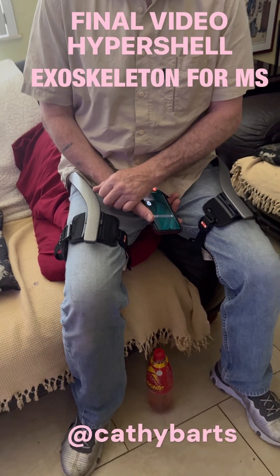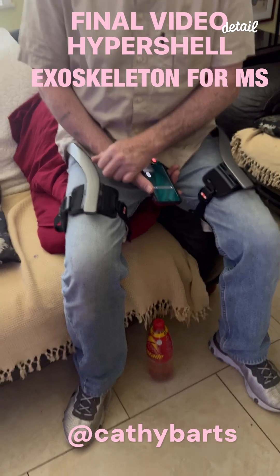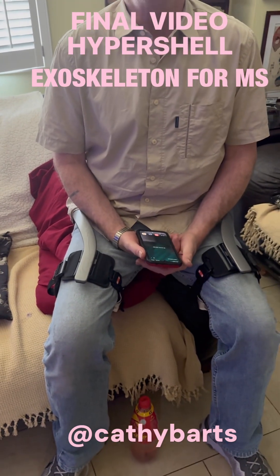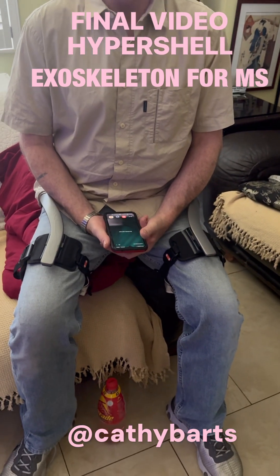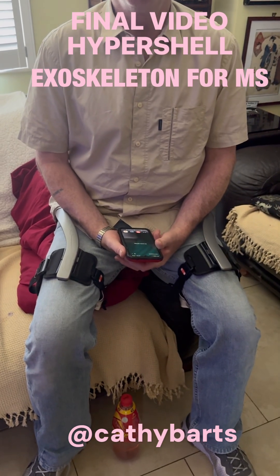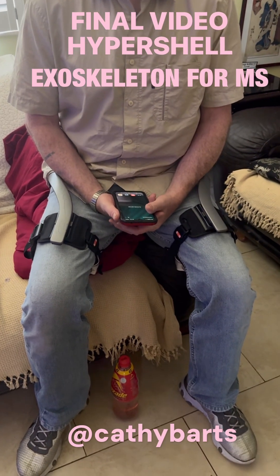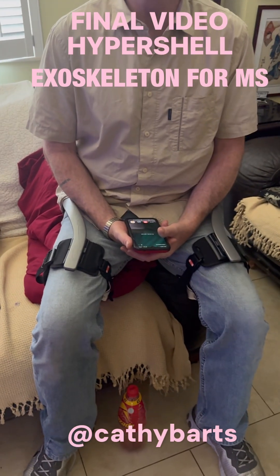This is the final video, a conclusion of my husband's experience with the hypershell exoskeleton. The conclusion is basically: I have used it every day and I am starting personally to feel the benefit of the workout. You've got to remember this is a tool — it's not designed for people in our situation. This is for people that are athletic; I have adapted it to use.